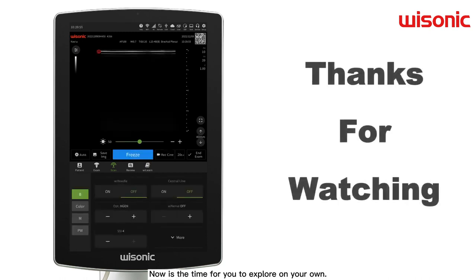Now is the time for you to explore on your own. Watch the instruction videos online or refer to the user manual.